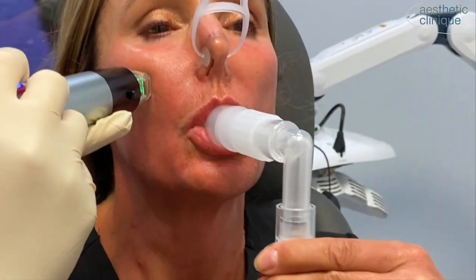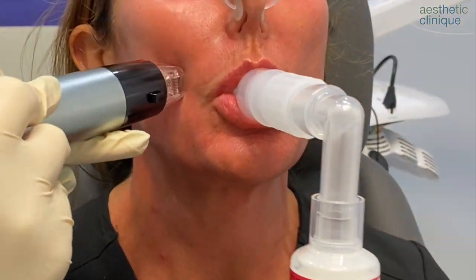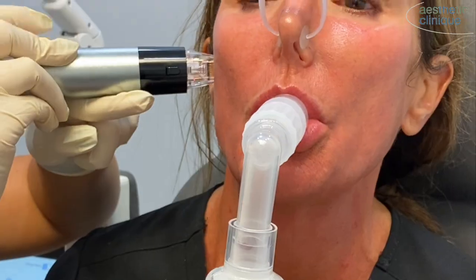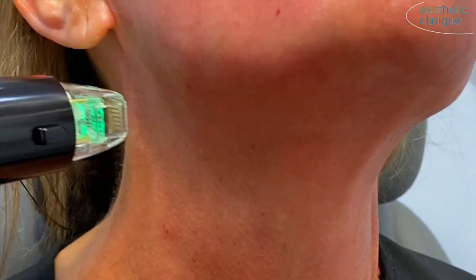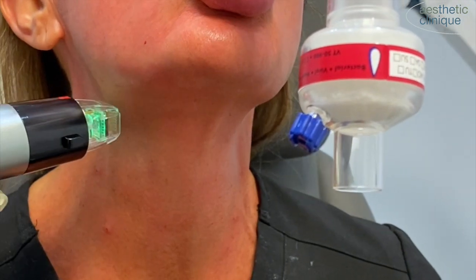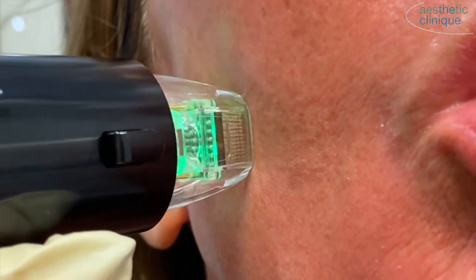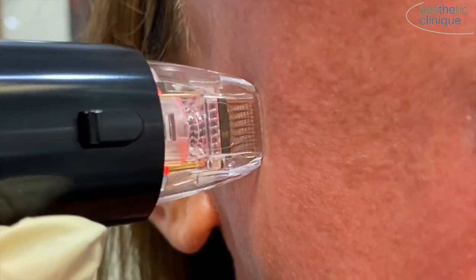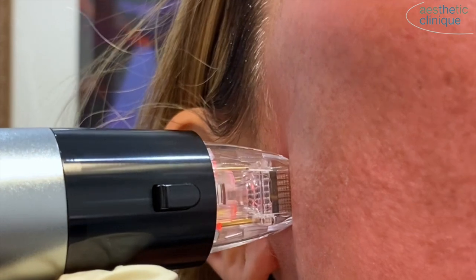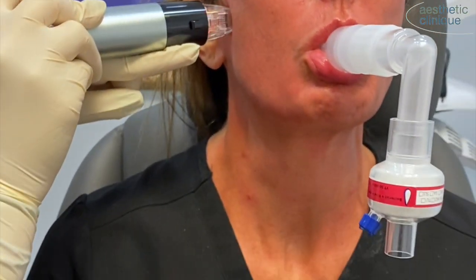And now we're performing the Genius procedure, which is RF microneedling. This causes improvement in collagen, elastin, and hyaluronic acid, and leads to tightening. So what we're doing is improving collagen from below with the Radiesse injection and from above using the RF microneedling. The patient is using Pronox, which is nitrous oxide, to improve comfort during this procedure. She is also using the care filter, which improves the safety of both the patient as well as the provider.